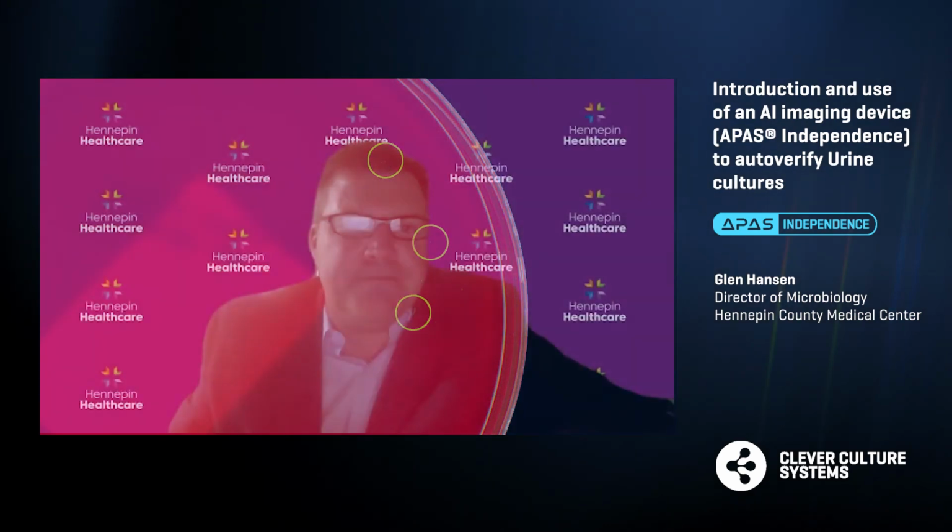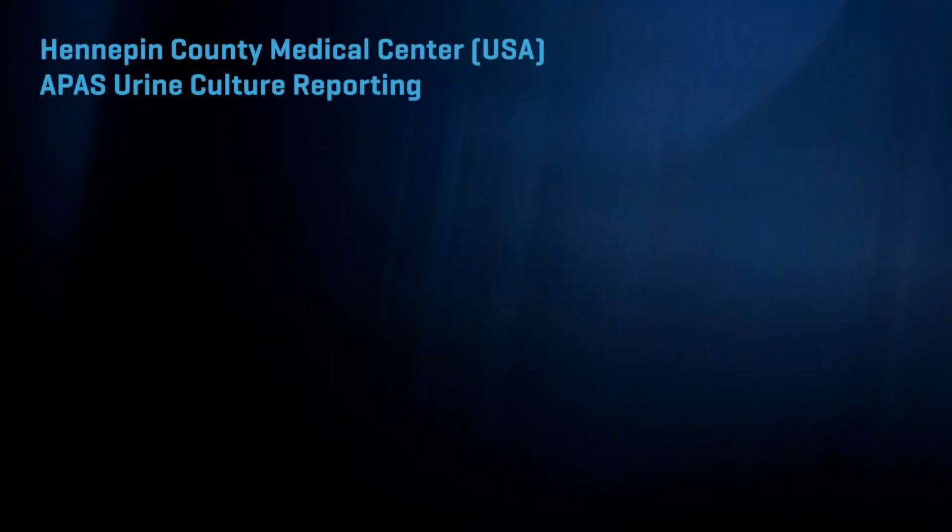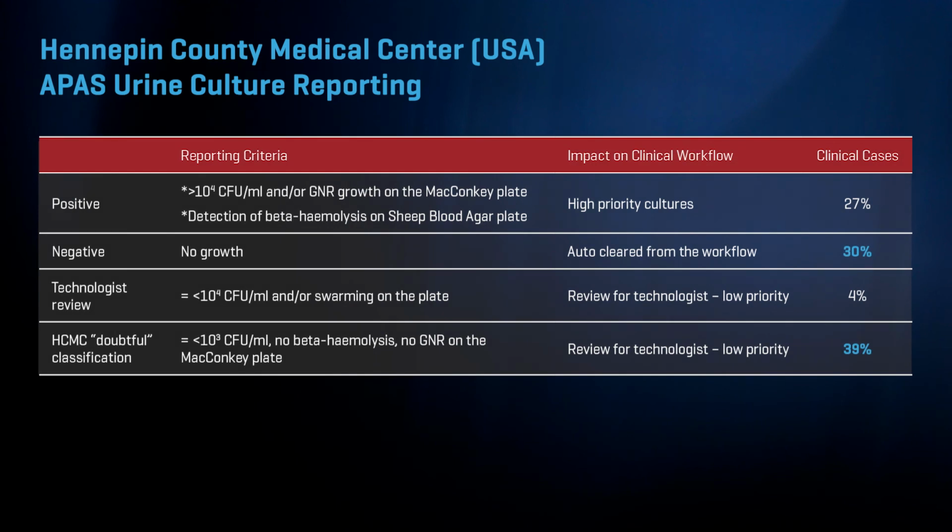So this slide demonstrates Hennepin County Medical Center in the United States, their APAS reporting structure in our laboratory. You can see on this slide, we have on the left column 4 reporting structures, from positive to negative to technologist review to a 4th category that we've worked with the company to develop that we call HCMC Doubtful. And we'll run through what these categories mean for you now.